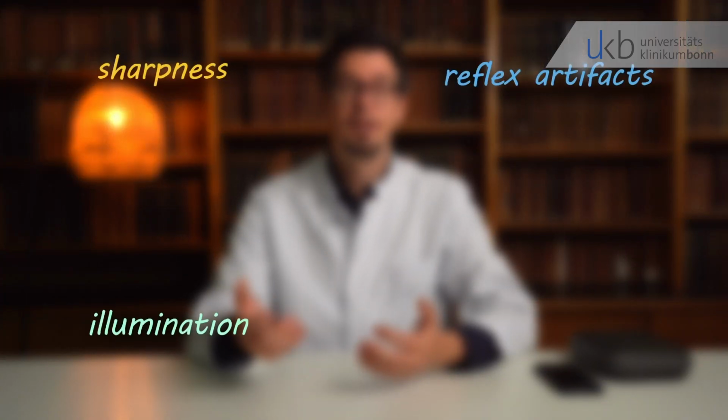Before you release the shutter, your image should meet these criteria. So remember, sharpness, reflex artifacts, illumination, and field of view.